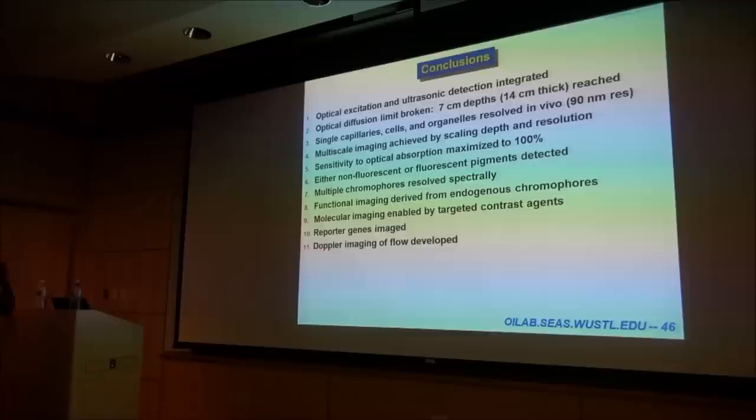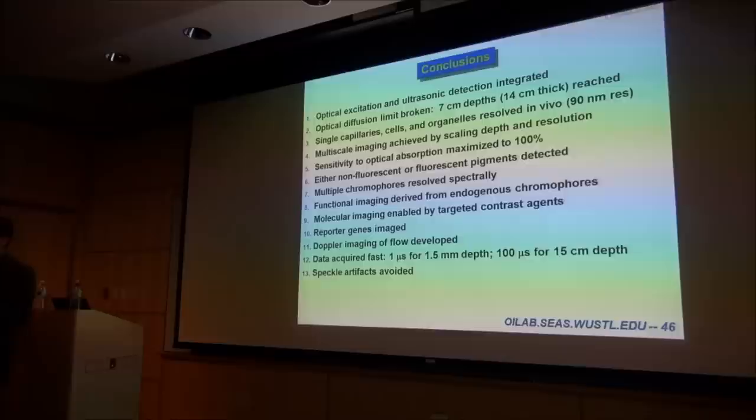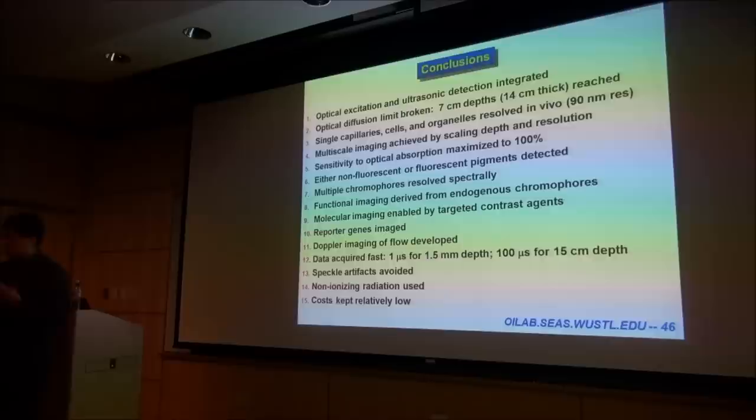Data acquisition is very fast, depending on the range of the data acquisition. There are no speckle artifacts, as you might have realized. Right? A little different from OCT imaging or ultrasound pulse echo imaging. But transmission ultrasound tomography generates speckle-free images as well. We use non-ionizing radiation, very safe. The systems are relatively low cost. Right? So this is relatively so in the medical imaging world.